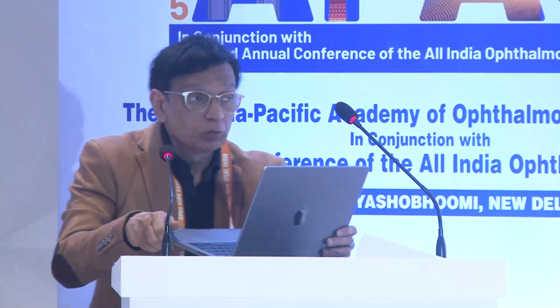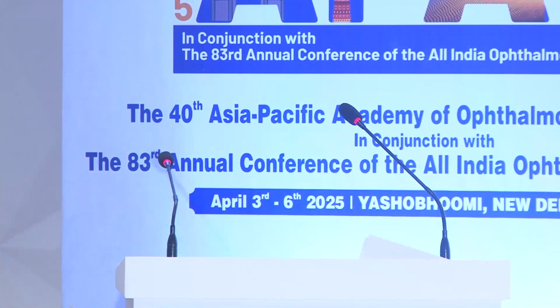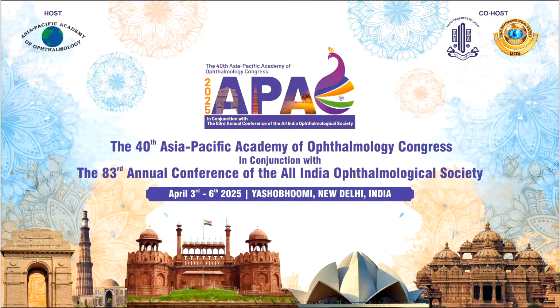Dr. Gaurav, can you set up? How do you see the fundus in such patients, and if required? So basically, you can see the fundus 160 degrees plus, with either the Mirante from Nidek, the Zeiss is there, the Optos is there, and the Heidelberg is there. These are all laser scanning ophthalmoscopes, which will give you a fantastic picture.